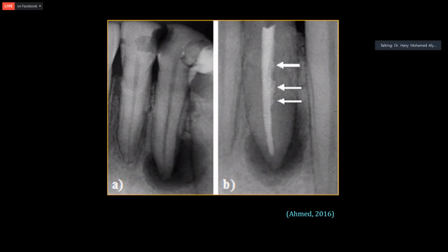So for example, in this case, when I had done obturation, I observed that the sealer goes into like an empty space. Và trên cái ca này như bác đang nói thì sau khi hàn xong chấm bít ống tủy xong rồi thì bác chụp lại phim X-quang và bạn phát hiện ra những cái đường mà ống tủy nó chạy ngang sang, những cái đường mà cái vật liệu chấm bít ấy, nó chạy sang vào cái khoảng trống.